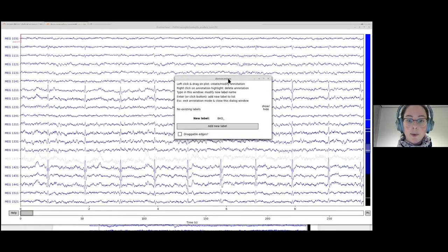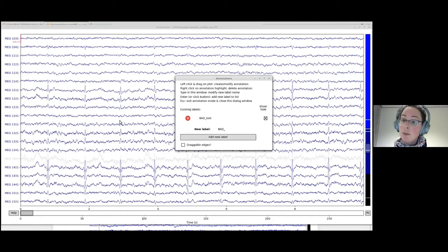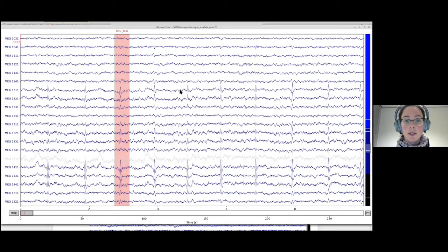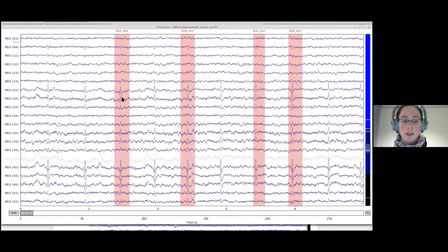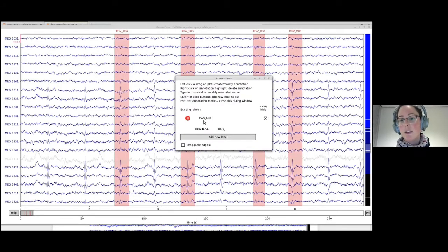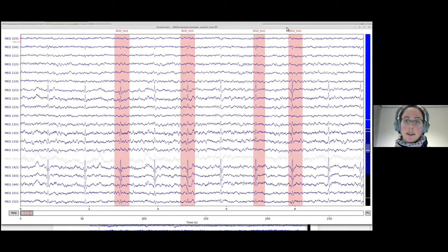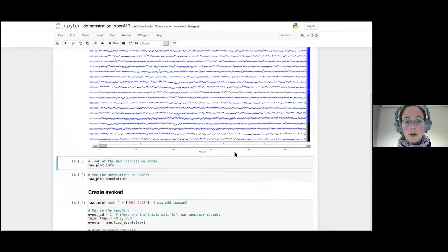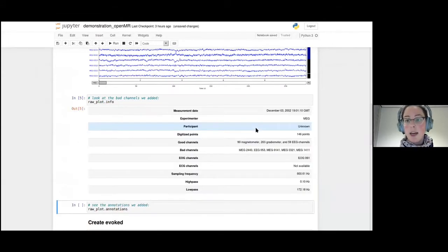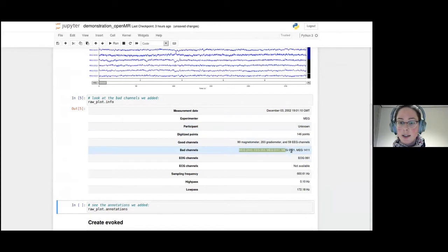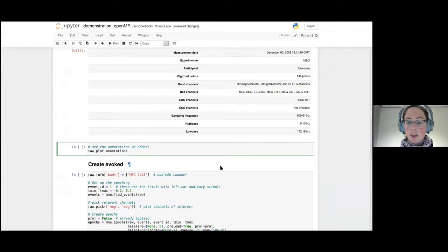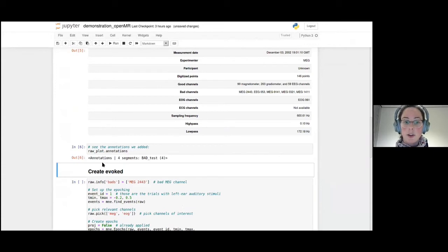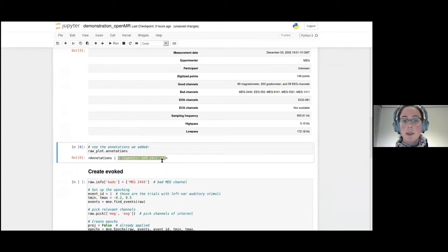When scrolling through your data, you could say you don't like a particular channel and want to get rid of it. You just click them and they will be grayed out and remembered as bad. You could also mark segments — for example, interactively marking heartbeats in your data and giving them an annotation. If we now close this and look at the info of the raw object, we can see we marked several channels as bad channels, and that we marked four segments as annotations.